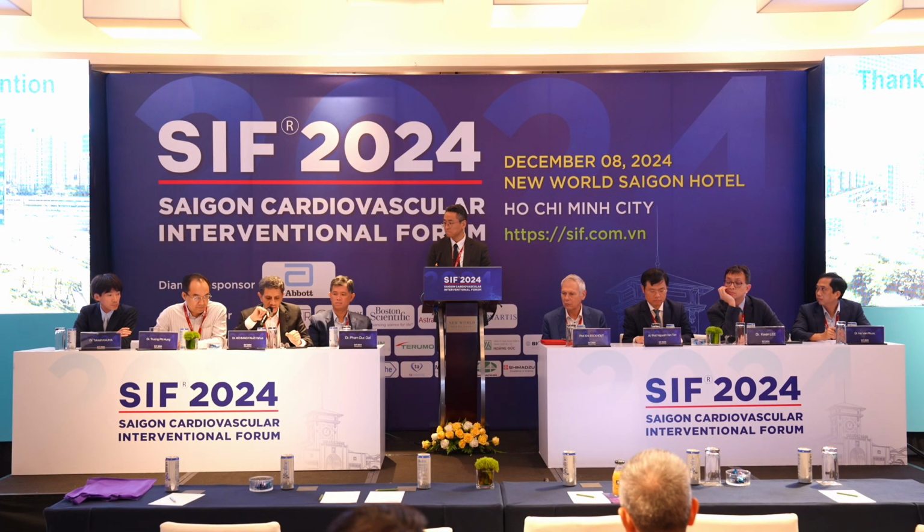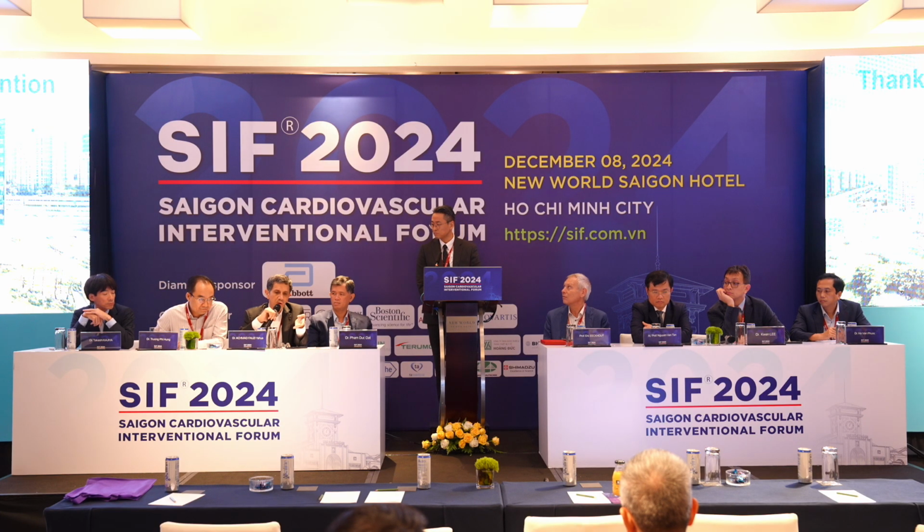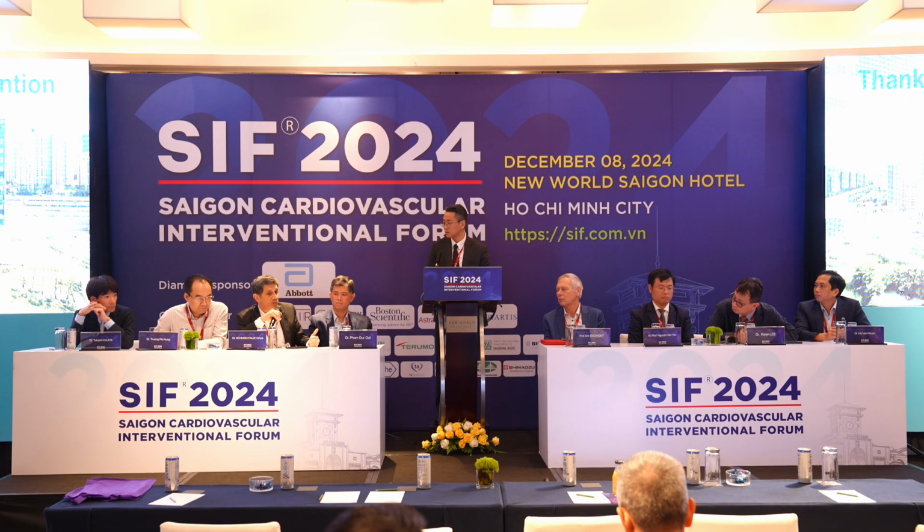That's a problem. And the second comment I want to make is that we understand well that the cause of in-stent restenosis is the mechanical problem, which is an underexpanded stent. So at that point, maybe IVL will work, but some centers don't have IVL. But if you are using rotational atherectomy, maybe not such a number, three burrs, right? Yeah, three burrs. 1.25, 1.5, 1.75. For such situations, maybe one burr with a 1.75 will work. What do you think about that?